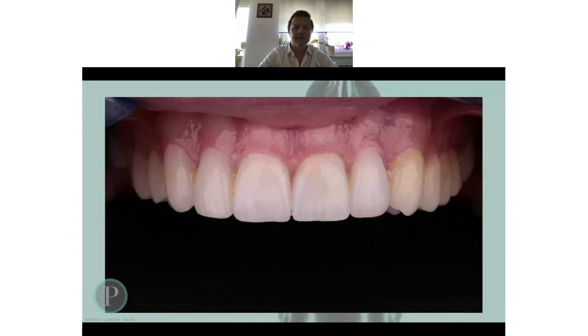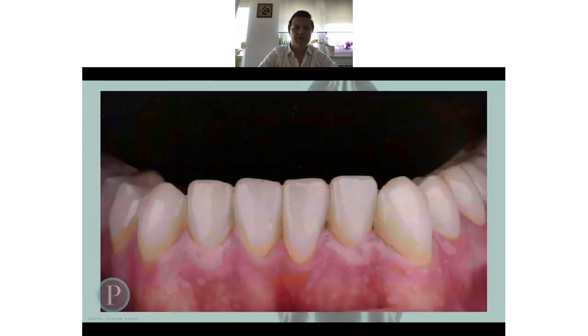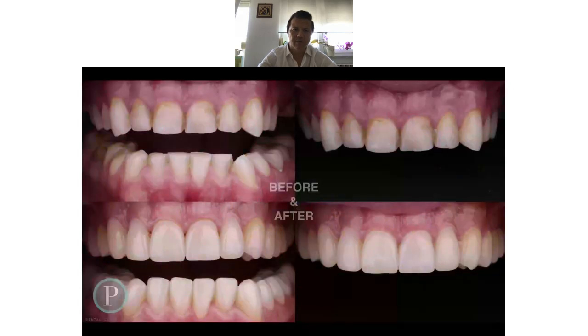And this is the upper jaw. I think the margins are very good. Don't forget that this is done fully digitally. There were no cords put in the gingival sulcus, only scan and final production. As you see, when I spoke about this situation before and after, on the left side you see the incisor, and the character of the incisors is the same.